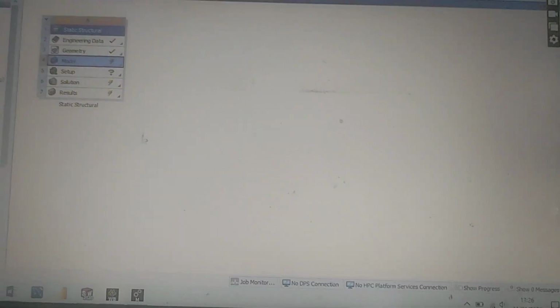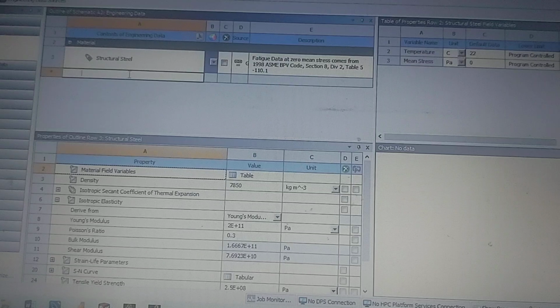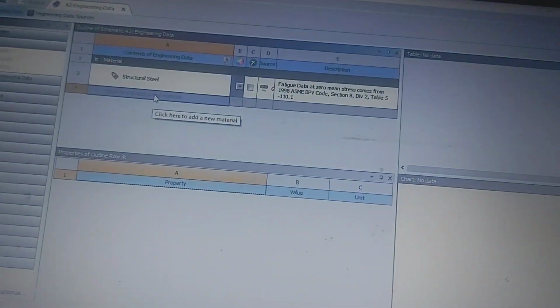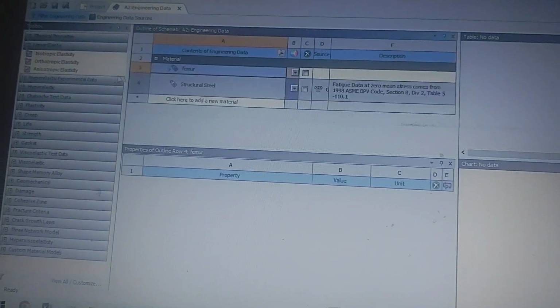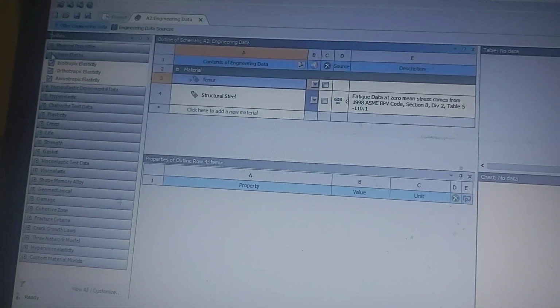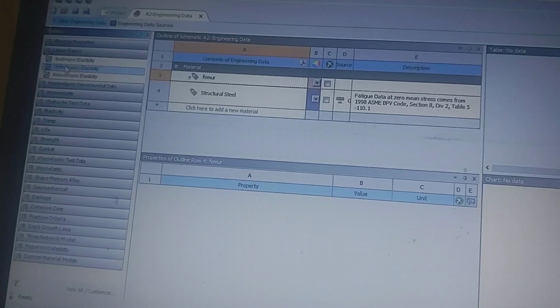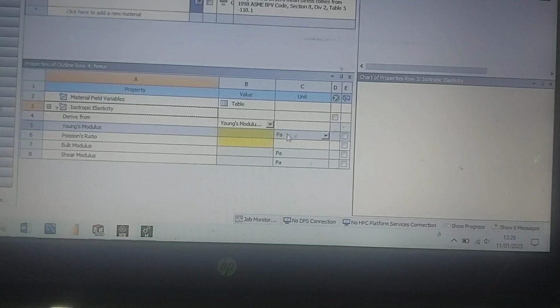This is Ansys. You can add engineering data from here. The window is opening. You can click here to add a new material and give the name knee bone or femur bone. It's up to you what name you want to use. This question mark means this requires certain properties. Go to elastic material, where there is linear elastic, and double click on isotropic elasticity. Okay, add two properties here.